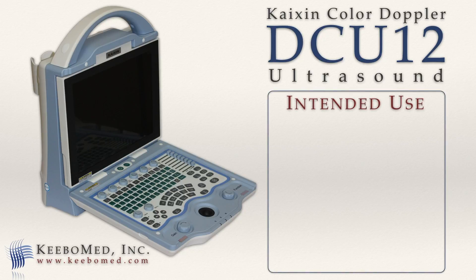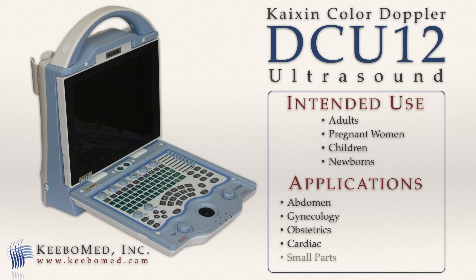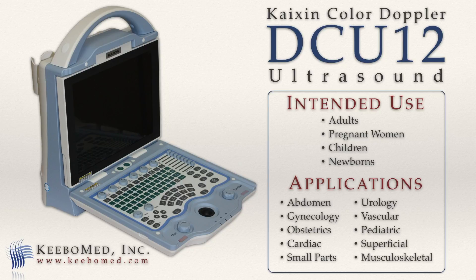The DCU-12 can be used on adults, pregnant women, children, and newborns to perform a variety of examinations. These include abdomen, gynecology, obstetrics, cardiac, small parts, urology, vascular, pediatric, superficial, and musculoskeletal.